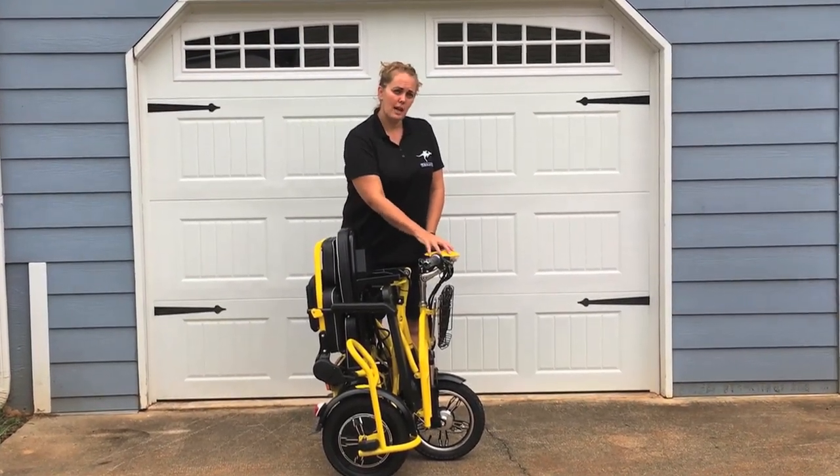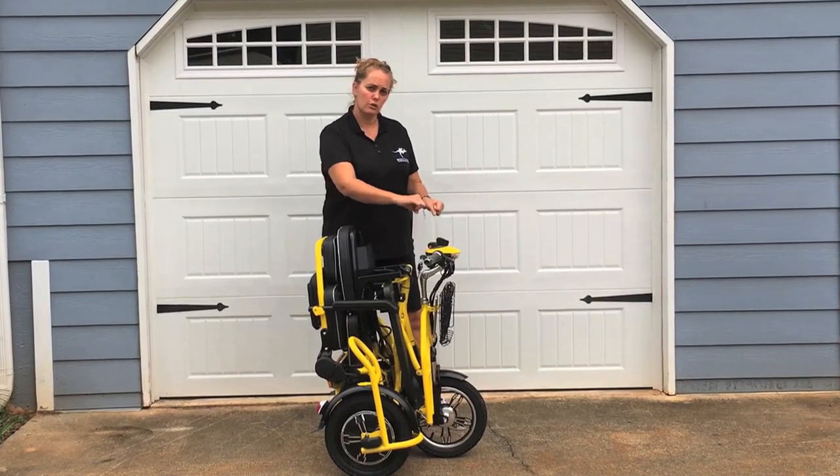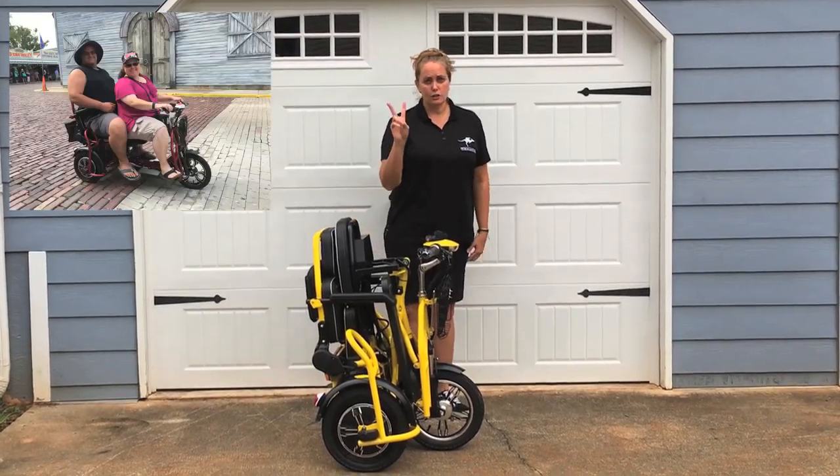This also has an adjustable stem so you can move the handlebars closer to you if you want to. It takes two passengers.